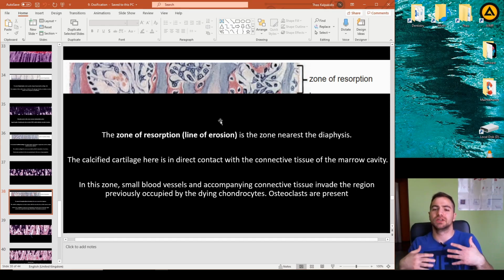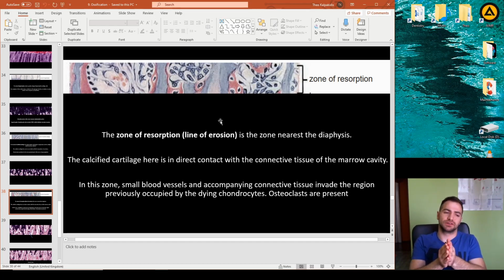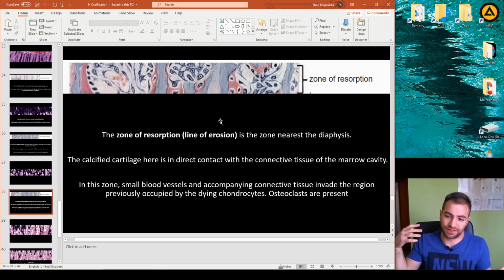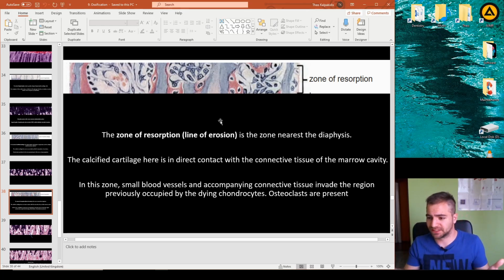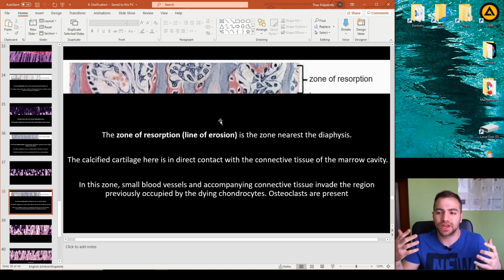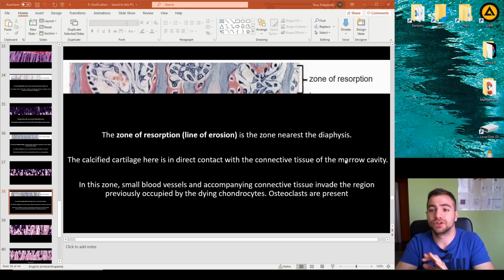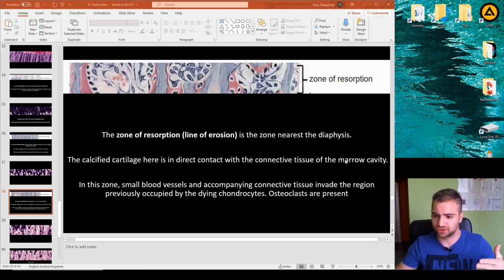So at this point, we're going to have to start discussing the two different opinions of histologists. Here we find the group of histologists that say that we have the last zone, the ossification zone, and that's it, and the ones that say that, well, we have two more layers within this tissue. So, let's start discussing what we can see histologically, and then we'll discuss the different classification.